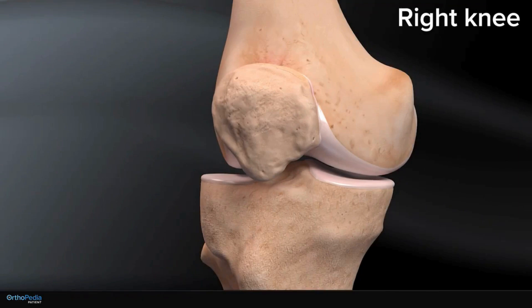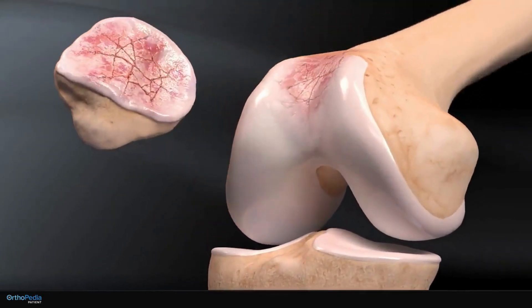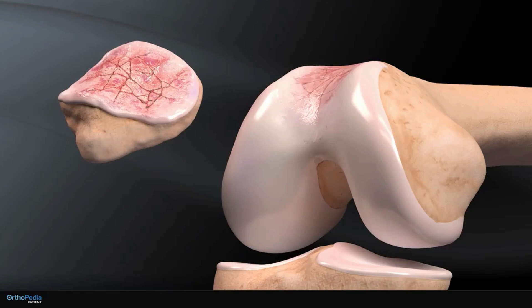An incision will be made along the front of the knee. The knee is bent and the kneecap is flipped over to expose the underside surface.